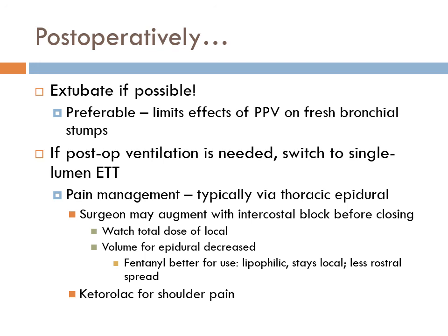If the bougie doesn't fit, you get an exchange catheter. This is an exchange catheter. It has a little device that hooks onto the top so you can actually ventilate through it. This side's a little bit easier to go through. Go in. You can watch this under the video scope too. You could go down the other port, I don't think it really matters. And then you pull your tube out. It comes out of the airway, being careful to leave the catheter. The catheter's hopefully not past the carina, it's very stimulating at the carina. So it's a little bit above the carina. The catheter's just sticking in the airway.